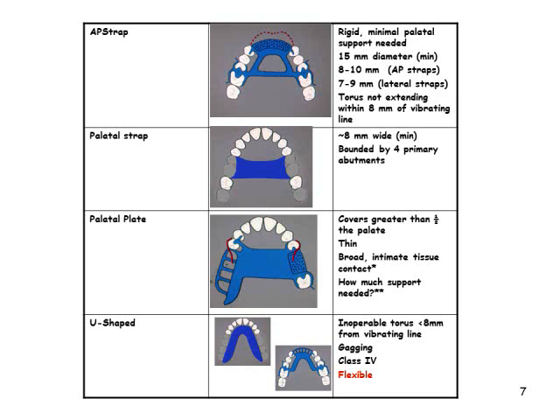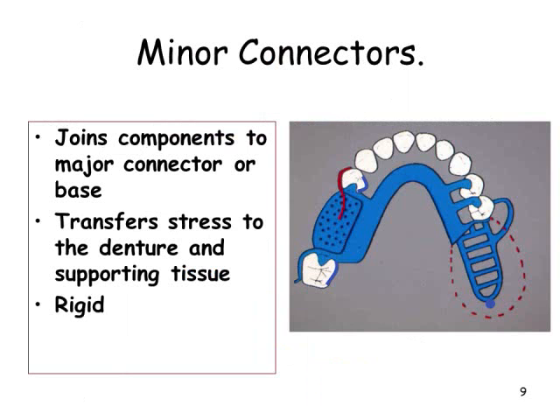Where it must be used, any portion of the connector extending anterior to the fulcrum line must be supported by indirect retainers. Border areas of the connector must be kept at least 6 mm away from adjacent teeth. If for any reason the anterior border must contact remaining teeth, the connector must again be supported by rests placed in properly prepared rest seats. It should never be supported, even temporarily, by inclined lingual surfaces of anterior teeth.